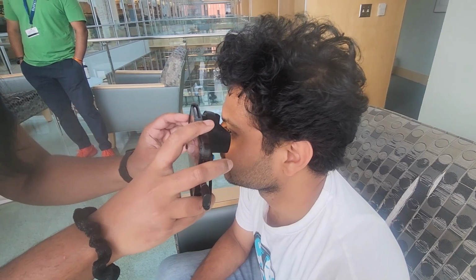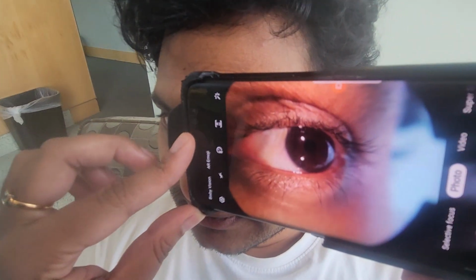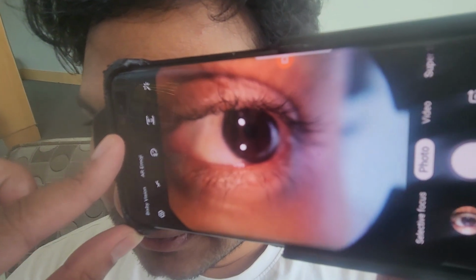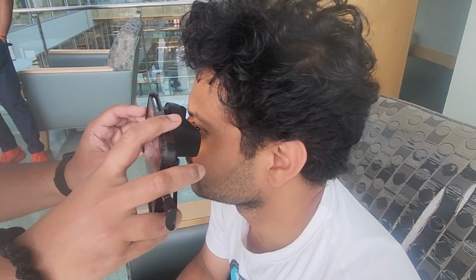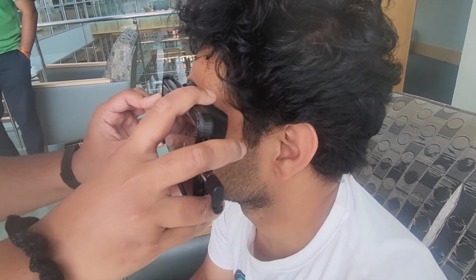Press the scope firmly against the face so no external light enters. If the image has unusual reflections, this may be because external light is getting into the picture. Make sure the scope is pushed firmly against the face so no outside light is shining in the eye.